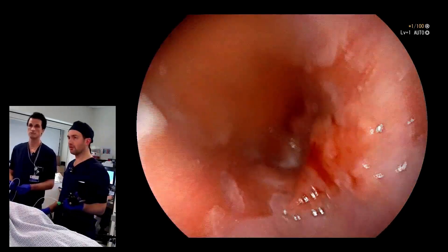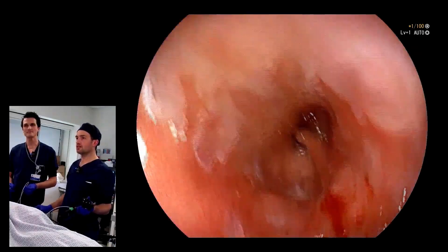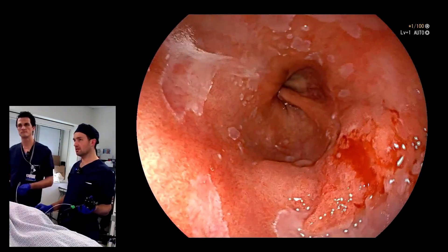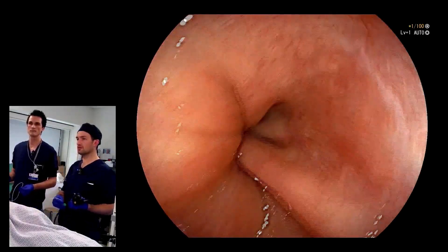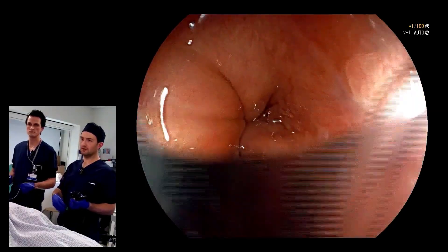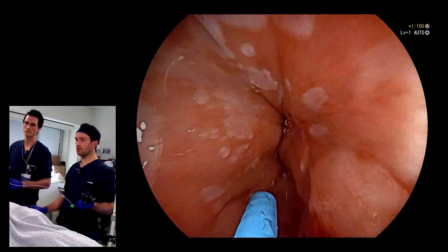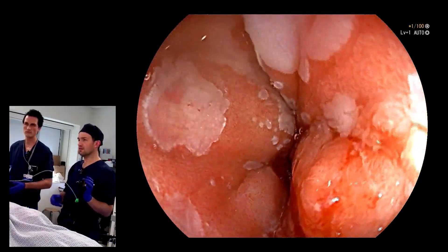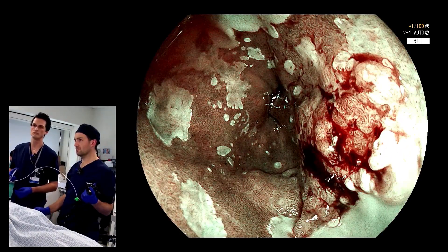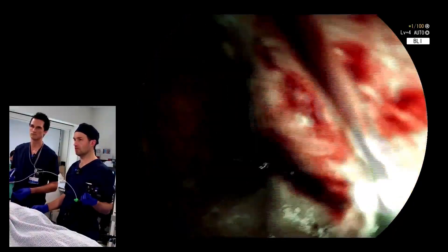We need more water than that. We are being restricted today in Ghent with the level of water we have. It's still pretty bad. So let's just finally do acetic acid — not because we want to really detect this lesion, but because we can demonstrate the parts of this which are very, very dysplastic and the parts which are not. We have already got a spray catheter. I don't think you need one for this, but if you do not have a magnifying endoscope, this is a very useful thing to do. Maybe we should just quickly show BLI first. So BLI here — it's okay, we get some sort of the structure, but the problem is we cannot really get closer. And if we put water in here, we're too close — we don't really get any image because we don't have magnification on this endoscope.